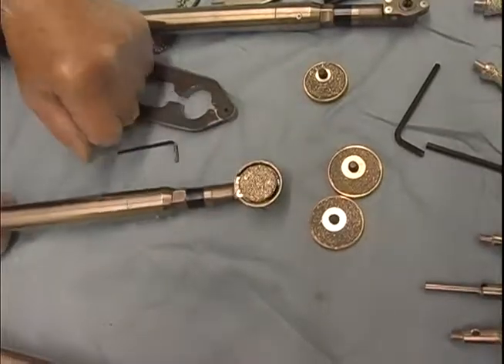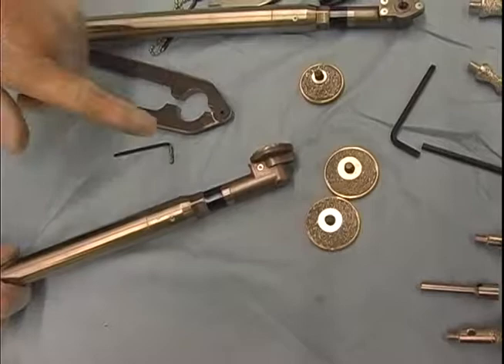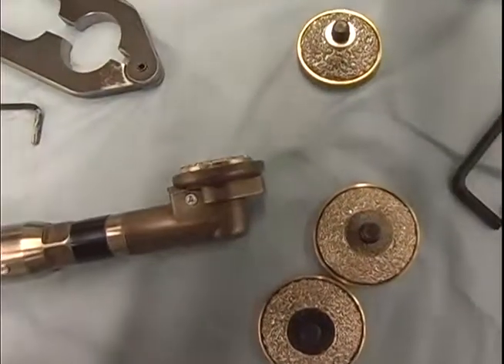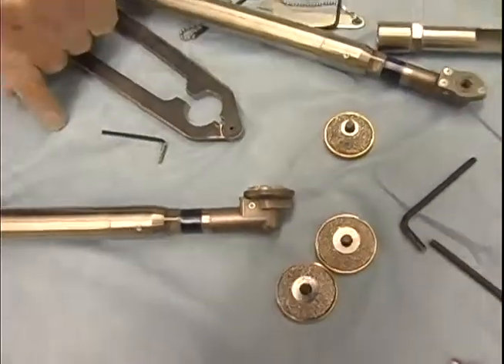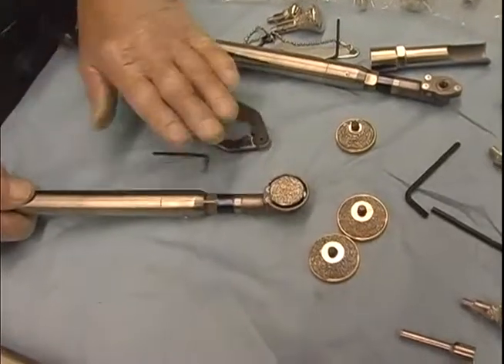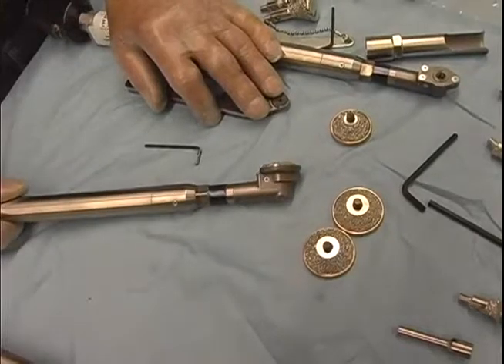If you look at the burr from the side, it should be slightly above the guard. If it's not above the guard, it's too difficult to float the back of the mouth. And that's why there's a washer underneath this wheel to elevate it up enough so that we are above the guard.